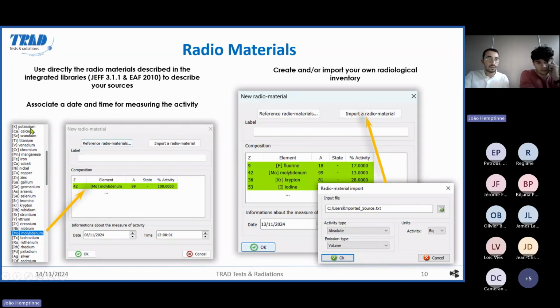You can choose the chemical elements you want, you can choose the isotope, and you can choose the percent of activity. You can set up a date for the time decay, so you have all the information. Or you can import a text file with all the information inside if you want to have a mix, or you can even set up the mix yourself. For example, this one I did with 18 fluor, etc.